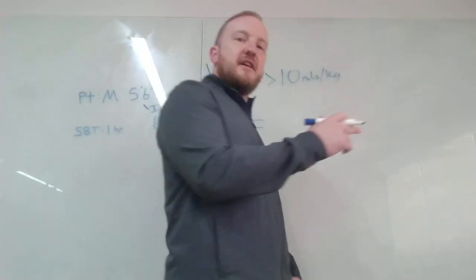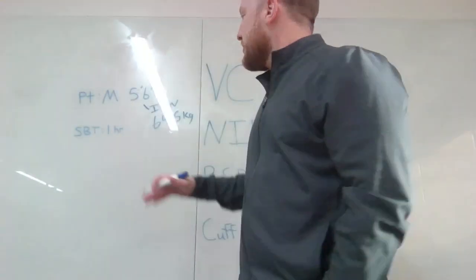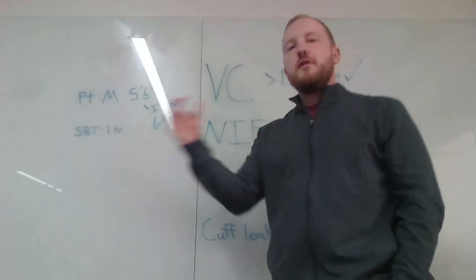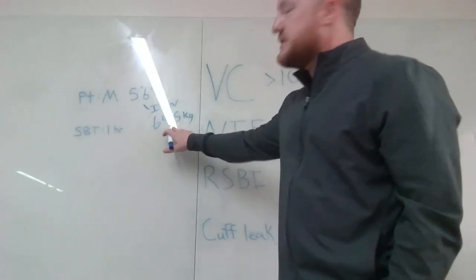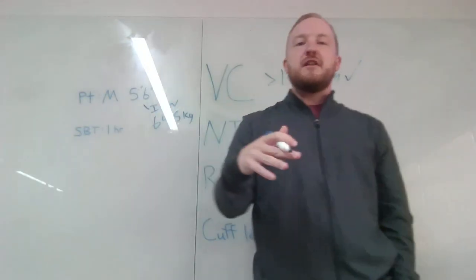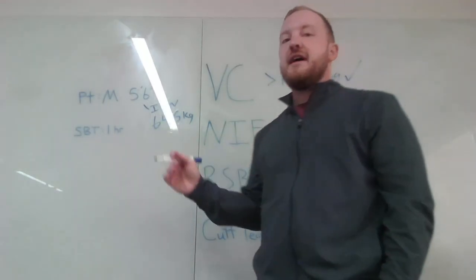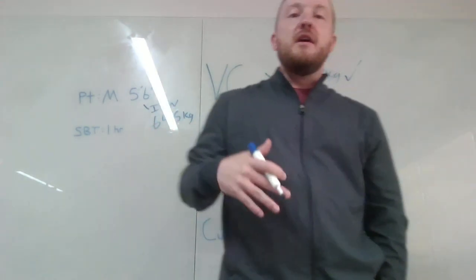Okay, so you're looking at the ventilator while your patient is doing this. As long as they come up and they're greater than 10 mLs per kilogram, then we're happy with that, right? If they pull less than that, let's say you have a scenario, your patient's ideal body weight is 64 and a half kilograms, and you do a vital capacity and the results come back and it's 400 mLs, right? So the patient did not meet 10 mLs per kilogram on that. So in that scenario, we're not going to look to extubate that patient yet, right? So we want to make sure.